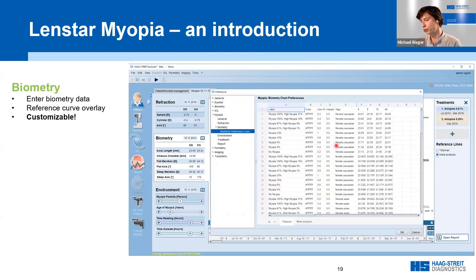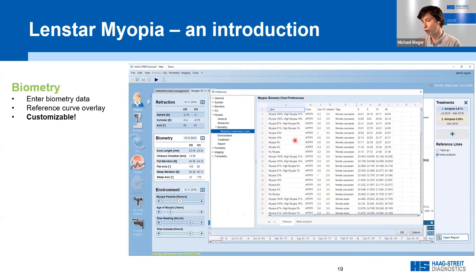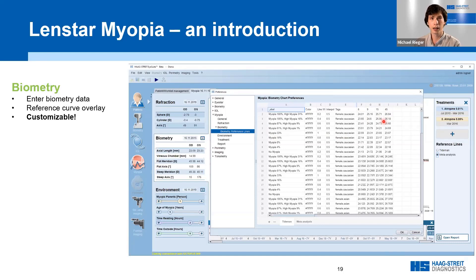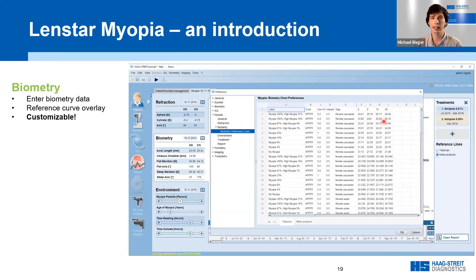To add these curves to the software, you can import them in a Microsoft Excel-like format, where the label, age, and axial length for each age are specified, and the curves are then drawn in our software. It's easy to import new curves. If you're from a region like Asia, the curves from Diez et al. can be directly integrated. And if a new study or refined data becomes available from, say, the Medical Institute of Rotterdam, that data can also be directly imported.